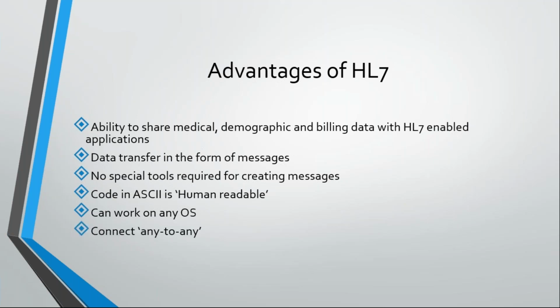Then, as I said, it will connect from any application to any application. All that we need to know is how do we build HL7 interfaces between different applications using an integration engine. And obviously, it will give a lot of assistance with respect to access to the overseas market. Different states can be interconnected with each other with respect to data to form a centralized repository, where government will have access to a lot of data of all the states that they are dealing with in any country. It could be in any country.